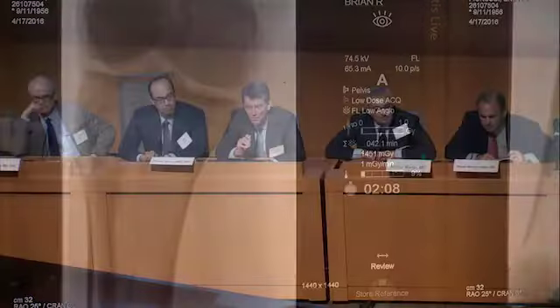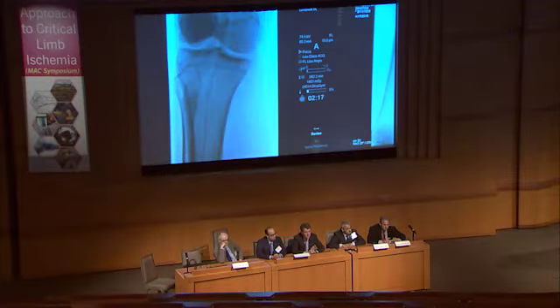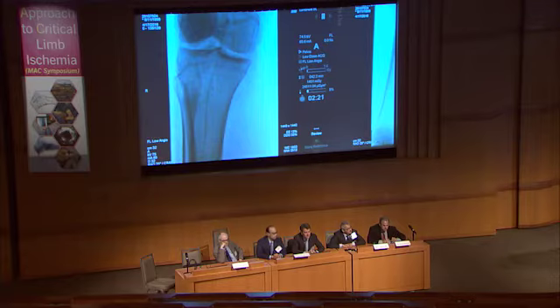Otherwise, if this balloon wouldn't open, maybe some other alternative balloons like a scoring balloon, VascuTrak, or high-pressure balloons. What do you think? Yes, and as Andreas said, we can use AngioSculpt, we can use Chocolate. Those are two options we have here. Obviously, there's always the opportunity to do atherectomy.